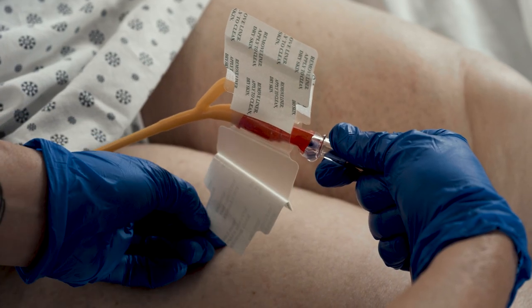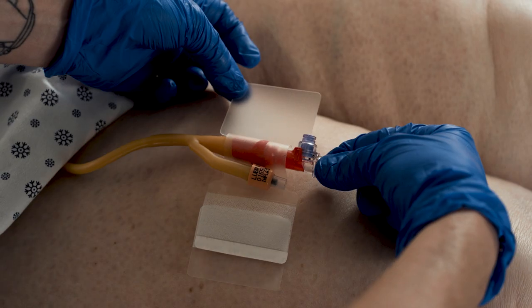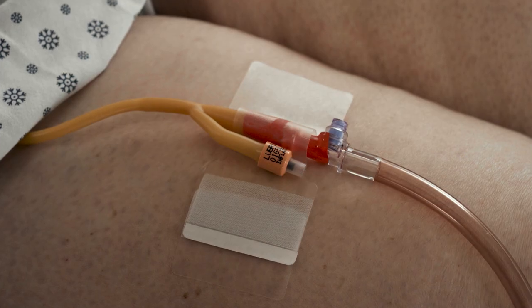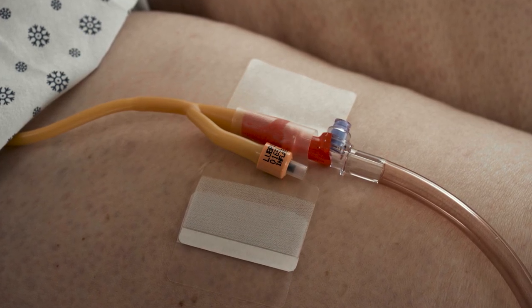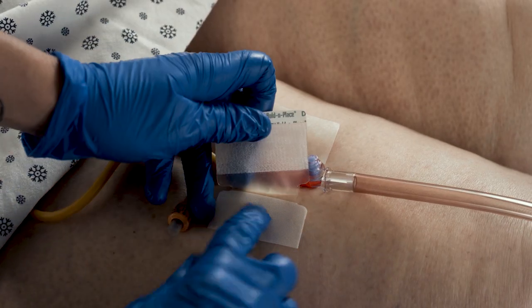Remove liners from the product's base to expose the adhesive and apply to skin. Leave an ample loop in the Foley catheter above the holder to avoid bladder traction. Adjust the tube if necessary.